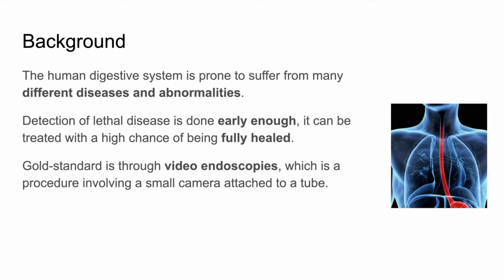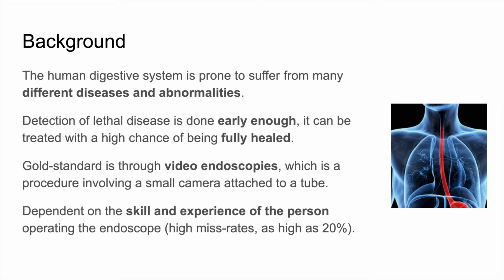The gold standard at the moment for this is video endoscopy. So a doctor takes an endoscope, puts it inside you, and tries to find these abnormalities. This, of course, depends a lot on the skill and expertise of the doctors. And they also often have quite a high miss rate.